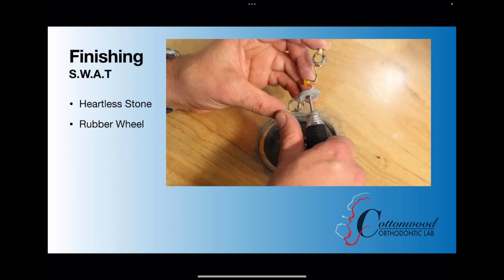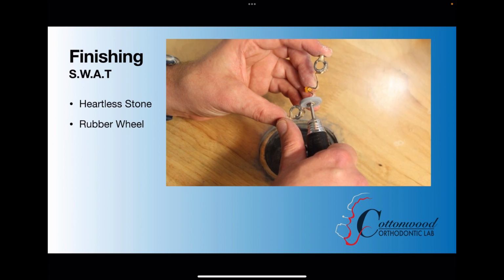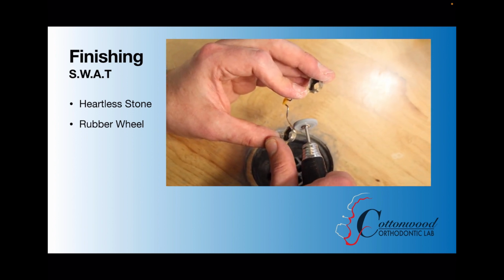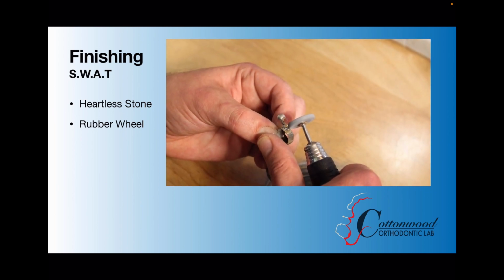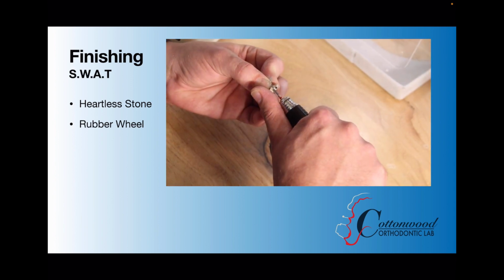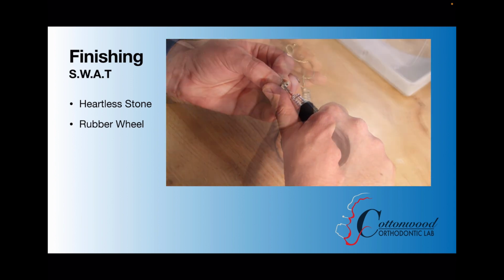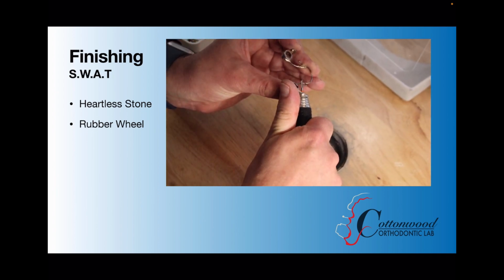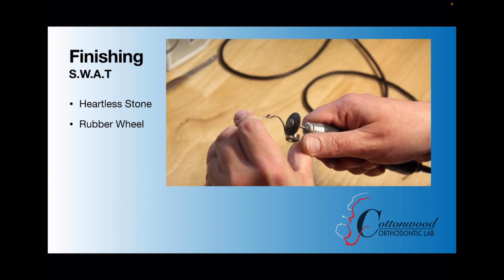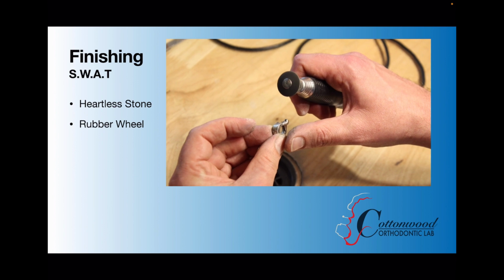So we're almost done. In our SWAT department, we call it solder, weld, acrylic, and trim. So we're just going to pretty much use a heatless stone and a black rubber wheel for final finishing. Occasionally, we like to use a carbide burr for the hard-to-get spaces, but it tends to be a little bit slower. So if you do a good soldering job, you should be able to smooth everything out, mainly with that heatless stone. We do like the black rubber wheels because they tend to last longer than the red wheels. Anything other color than that just tends to be too soft and you go through a bunch of them. So we kind of finish up with our final prep.